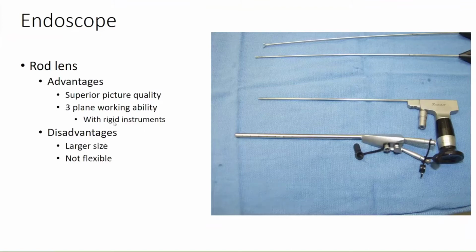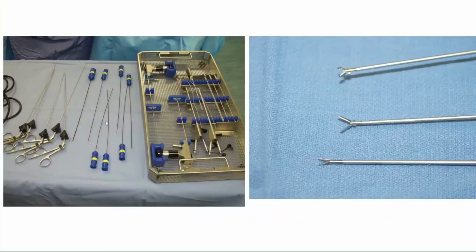So some of the instruments that we use in addition, we have these coagulation devices. Some of them are straight, some of them have these fancy curves on them. This is sometimes important, more so for ventricular dissection. Again, not necessarily relevant to the ETV case that I'm describing, but helpful for the residents to know.